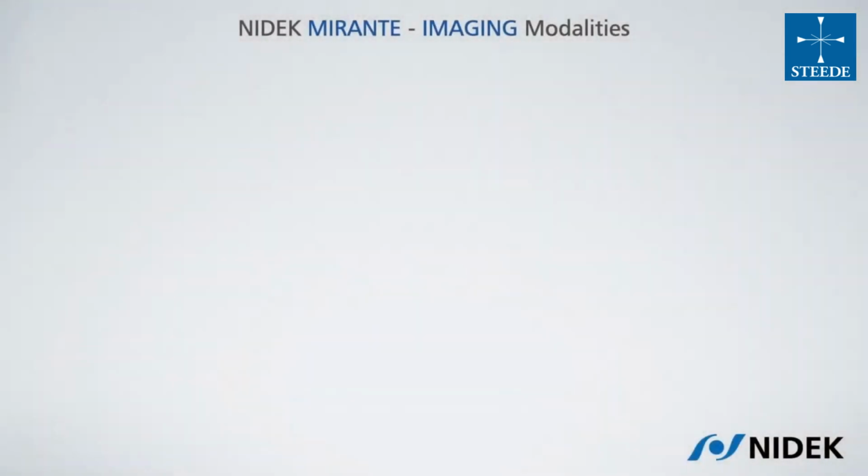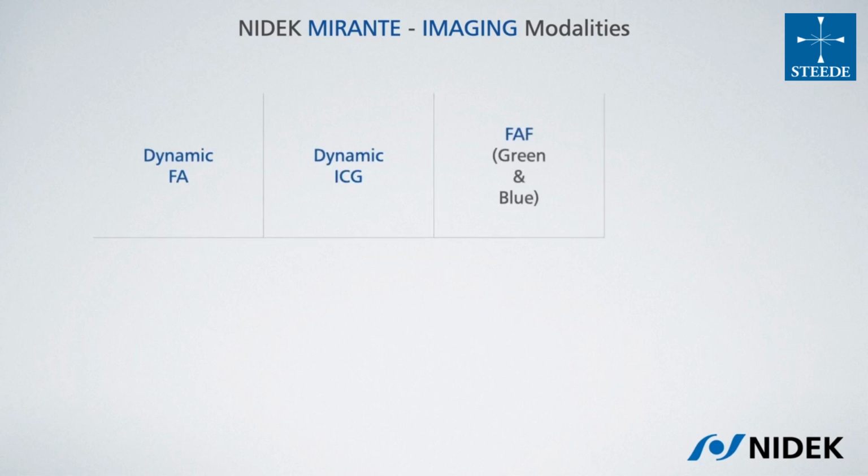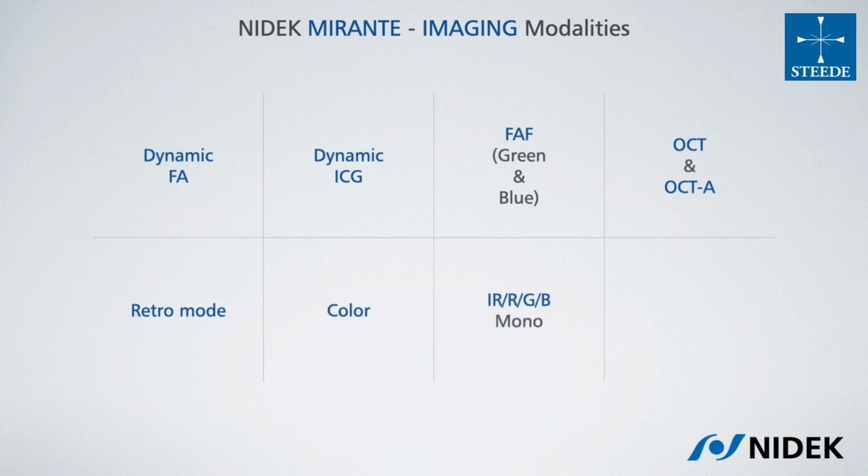So here is what you can do with the Nidek Mirante. Dynamic SLO-based fluorescein angiography, dynamic SLO-based indocyanine angiography, green and blue autofluorescence, OCT and OCT angiography, retromode imaging, color imaging, monochromatic imaging for infrared, red, green and blue, and ultra-wide field for FA, ICG, color and retromode.